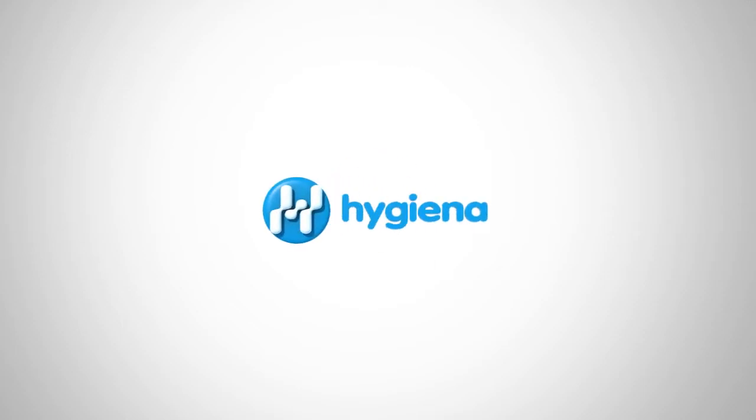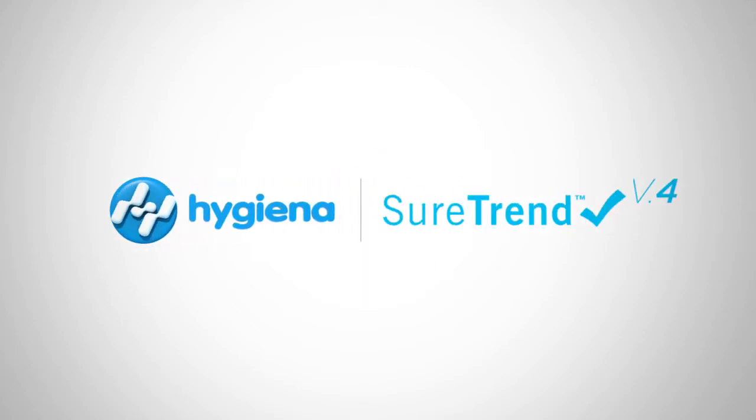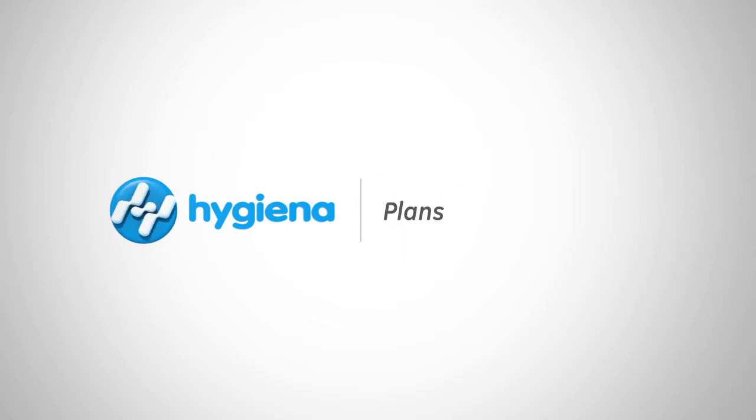Welcome to the SureTrend4 instructional video series for healthcare. In this video, we'll cover creating test plans. Let's get started.